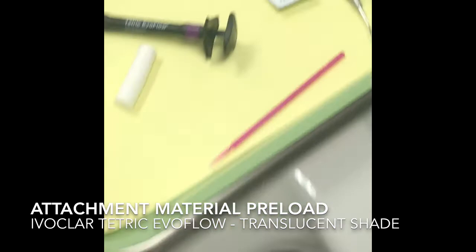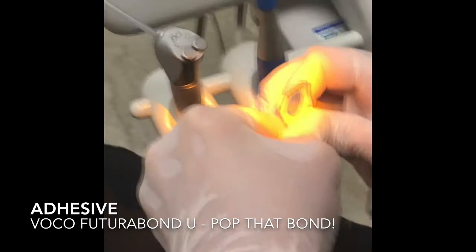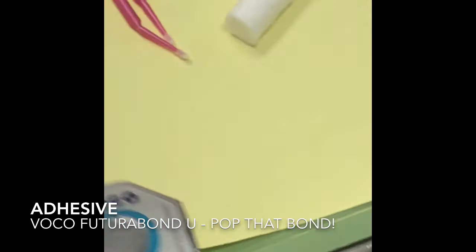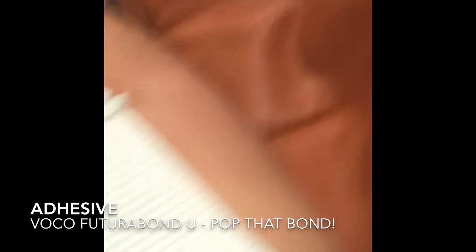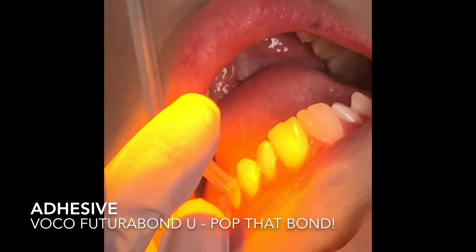She's going to use a self-etched adhesive called Futurabond - there are several other self-etched options on the market that work really nicely. If you have a two-step etch and bond, that works really well too, but you have to be careful with the primer and water - doing it by itself could be tough. She's going to dry the teeth really well with her orange filter light on.